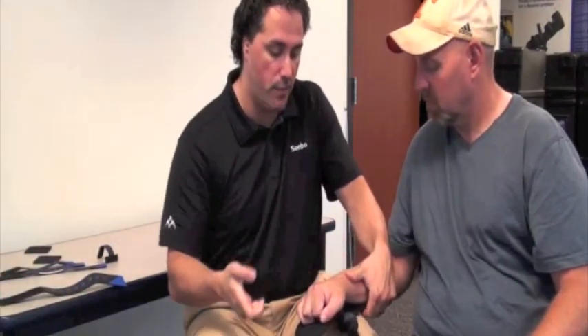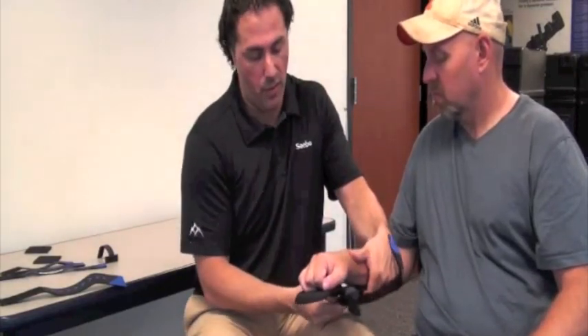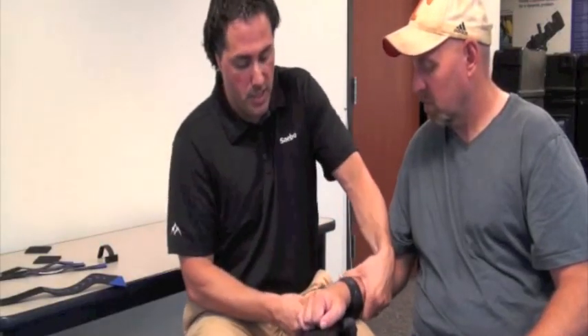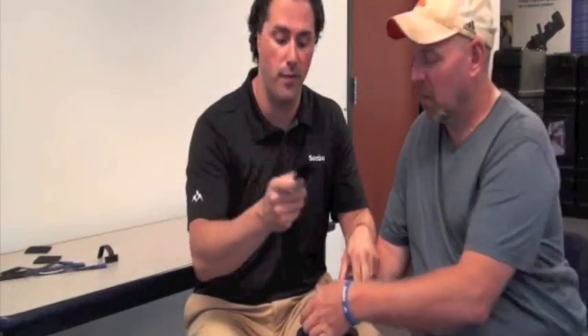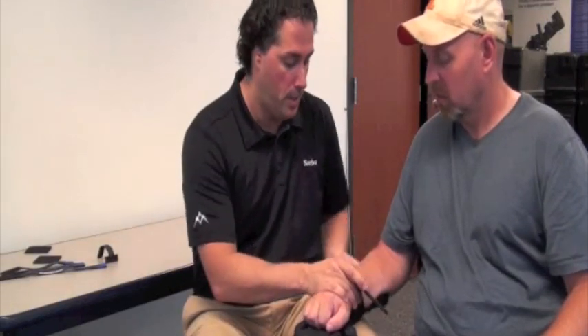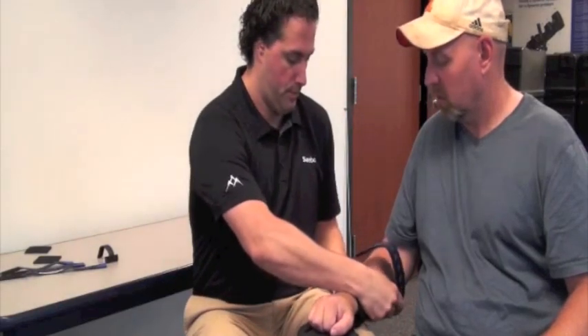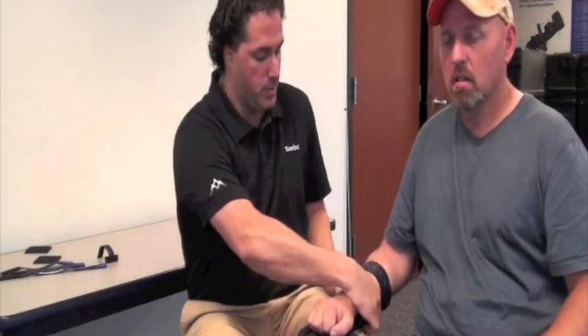Now that we know we're in a good position, we'll take the proximal and distal forearm straps. Starting with the distal forearm strap, attach it underneath the volar surface of the Sabo Stretch, apply some pressure, and have a snug fit — we can loosen up the straps later if needed. Then apply the proximal forearm strap — it's okay if the fingers stay in a curled position — and pull it down nice and tight.